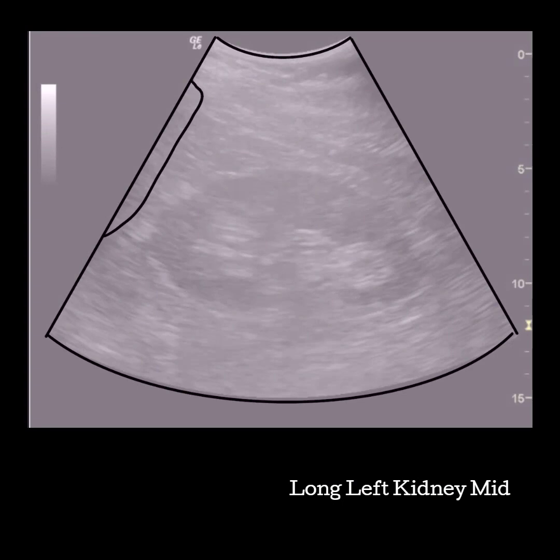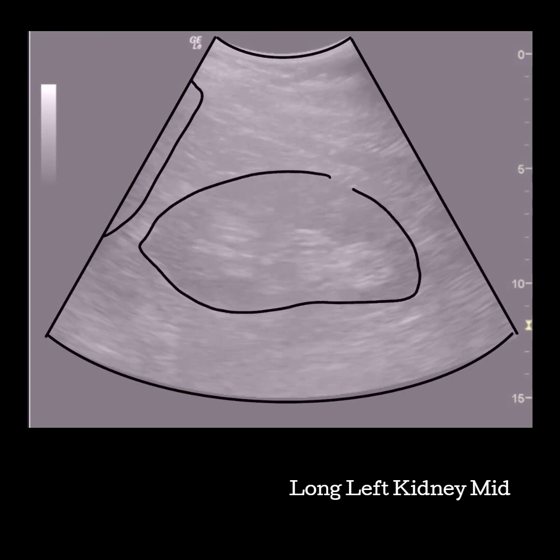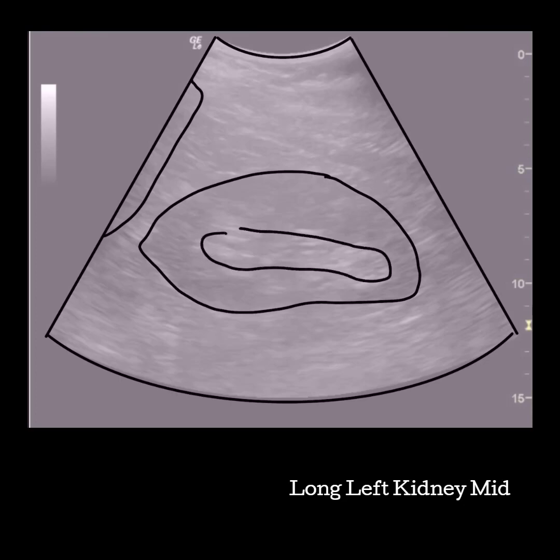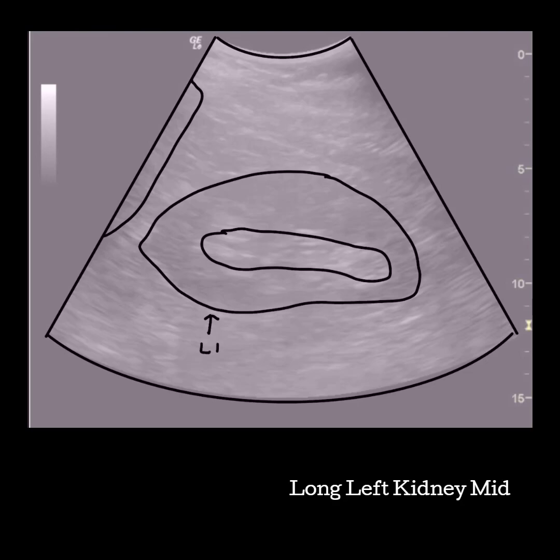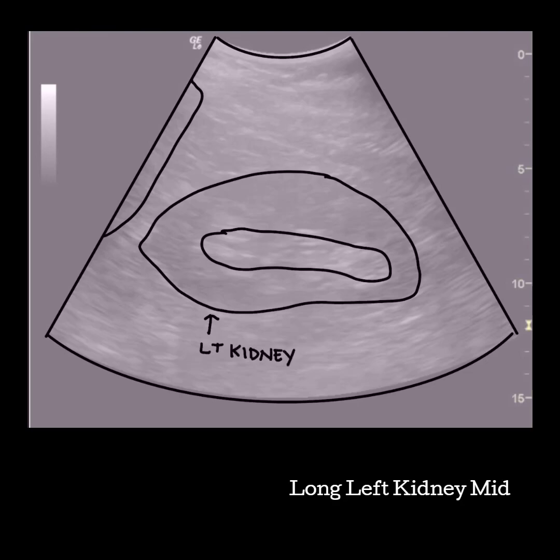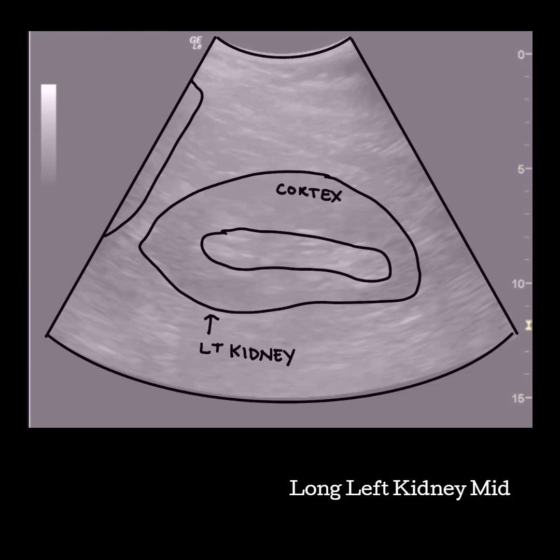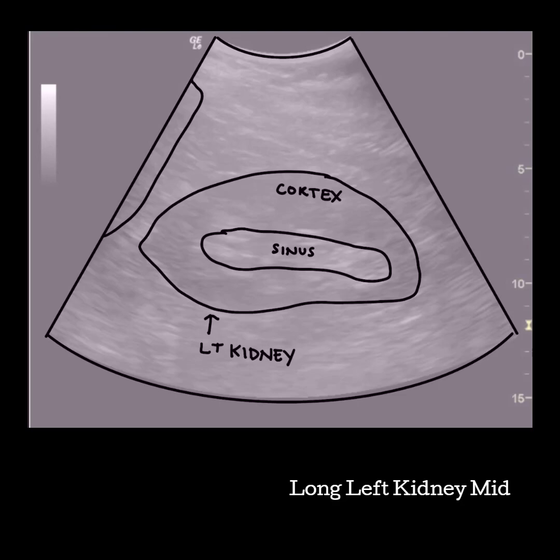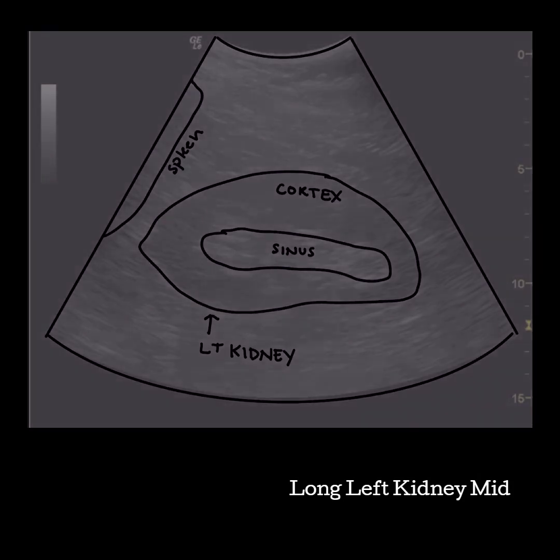Keep moving the beam towards you. Watch for the poles of the kidney to lengthen out and the cortex to be visible all the way around the echogenic sinus. You may see the spleen superior to the kidney. If the best window causes shadow over your kidney, try centering the shadow at the mid portion so you can measure the kidney, then staying in the mid plane shift the shadow to see the area you couldn't see before and take another picture. Remember, we're trying to show the renal parenchyma to the reading provider — it's okay if you have to take extra pictures to accomplish this.